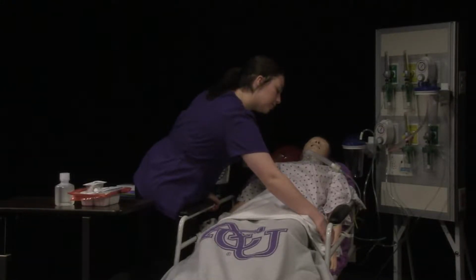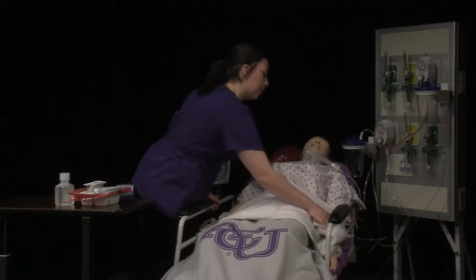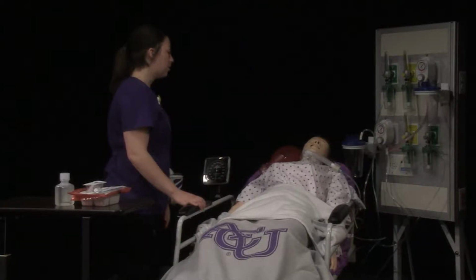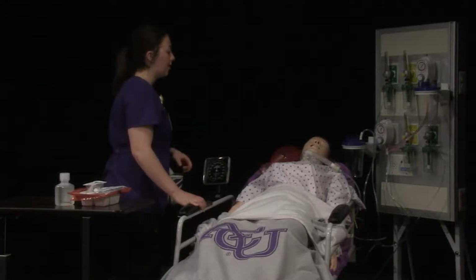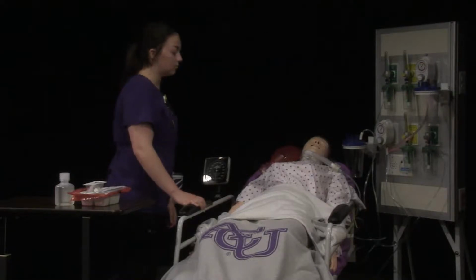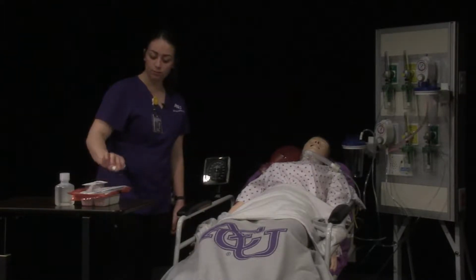Thank you, Ms. Roberts. Check for allergies. Do you have any allergies? And explain the procedure to the patient. So I'm going to be performing some tracheostomy care today. So what that means is I'm going to remove the old dressing and the old inner cannula, put on a new dressing after I clean the area, and then I'll also put in a new inner cannula and a new tracheostomy collar. Do you have any questions about that? Ensure that all emergency equipment is within reach, including the obturator.